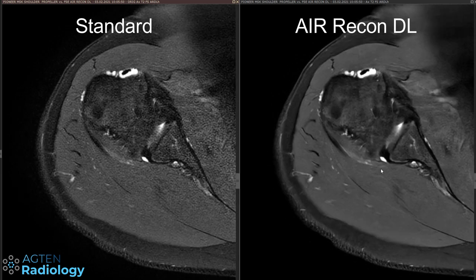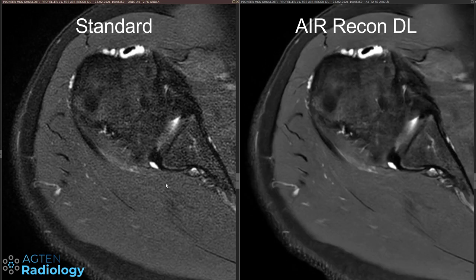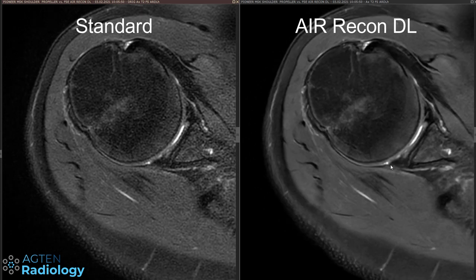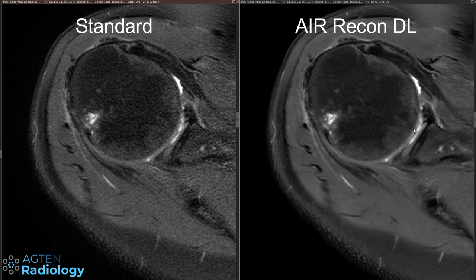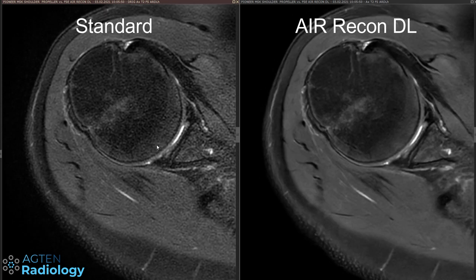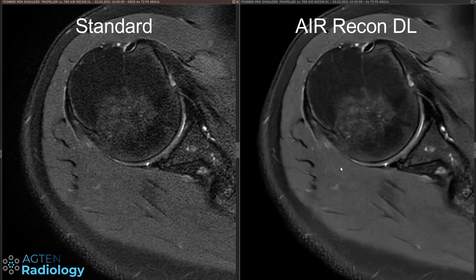If we look for pathologies, we can see a paralabral cyst here — we can certainly make all the diagnoses also on the other sequence. But if you look at the cartilage, it just looks much nicer, and the image has the impression of being a little bit sharper as well if you look at the lines and tendons. Even with these tiny vessels, we're not calculating information away — the information is still there with the enhanced image, it's just the noise that's basically gone.